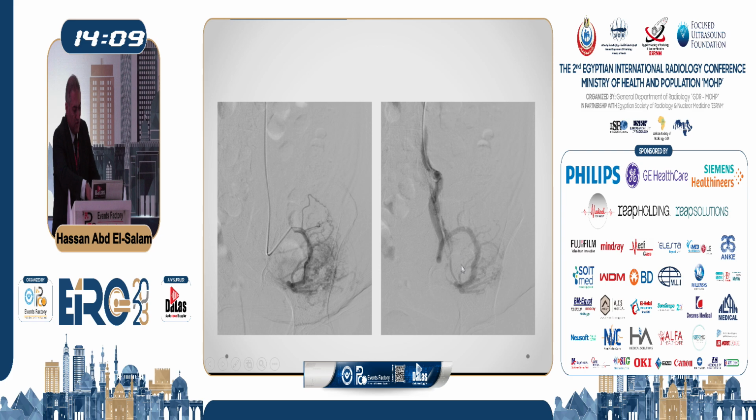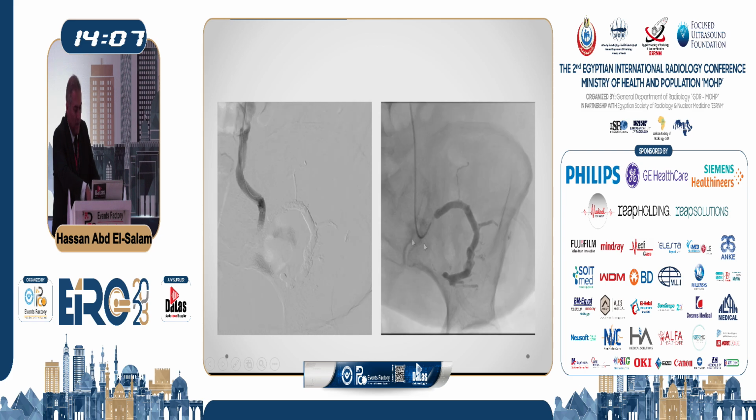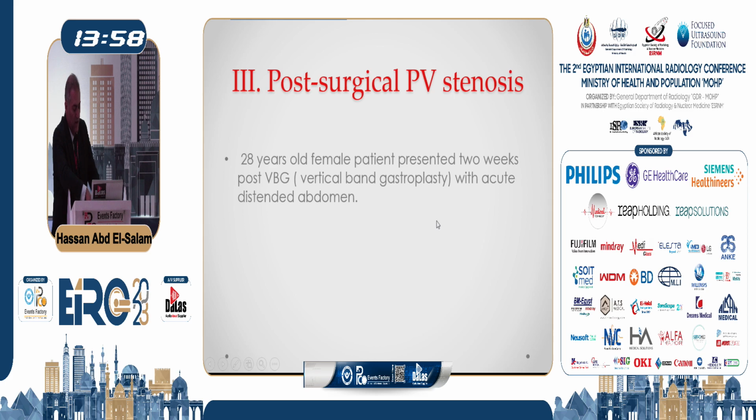You can see the peristomal varices here, and then glue, histoacryl, is used. This is the histoacryl, and the peristomal varices are occluded.